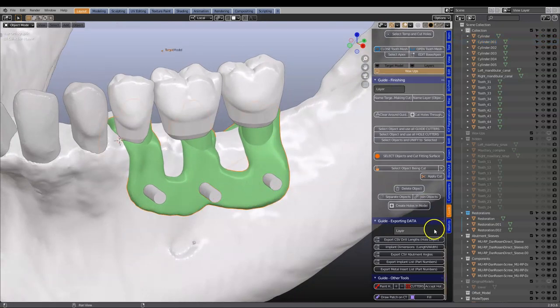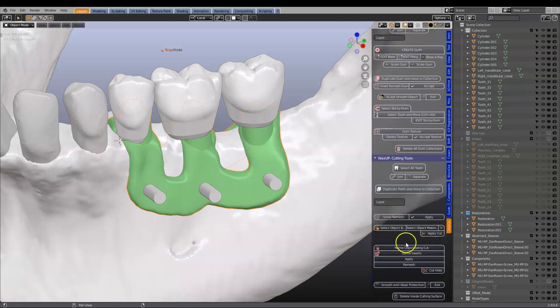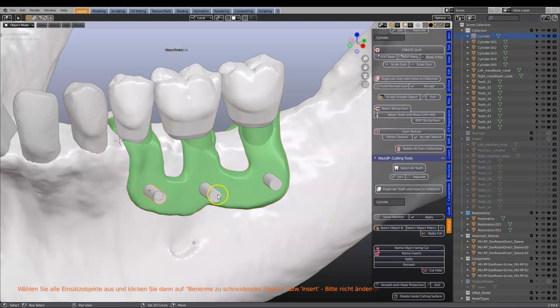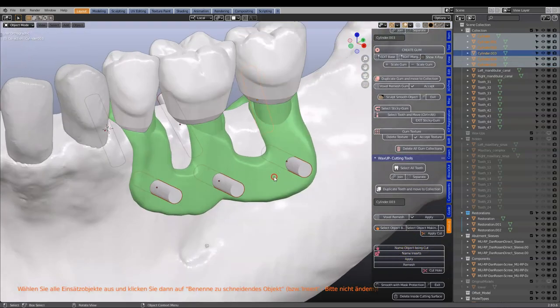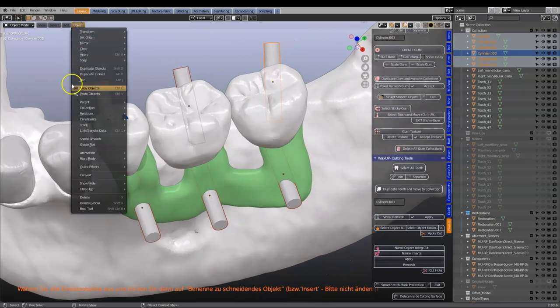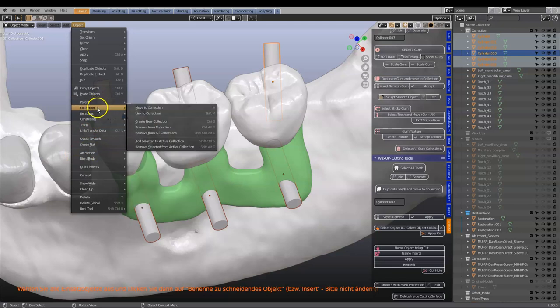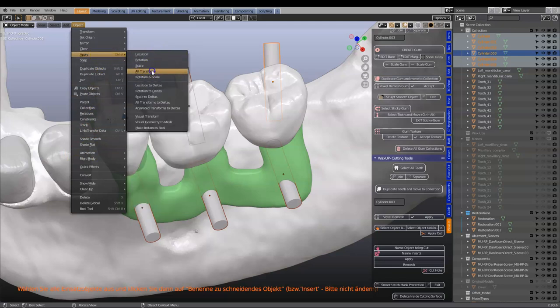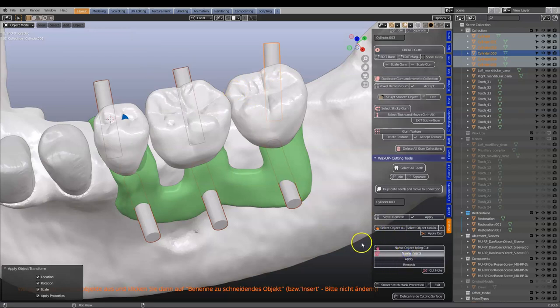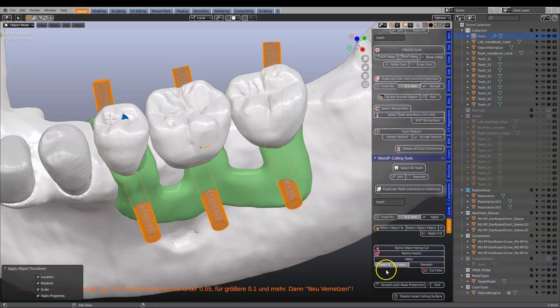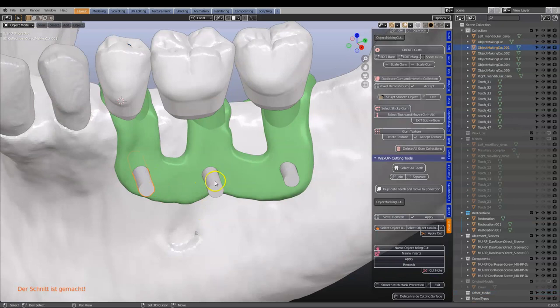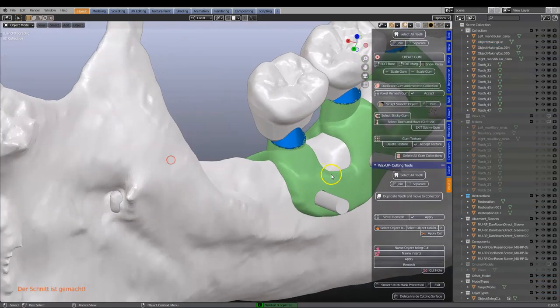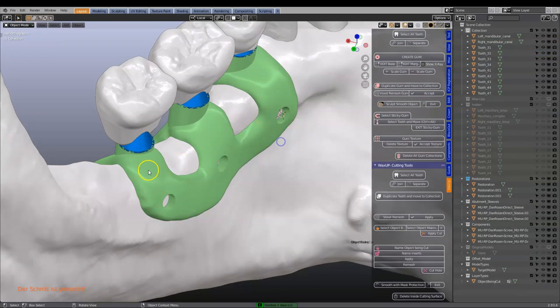Next we're going to select the green part, go to the WaxUp module at the bottom — this is the object being cut — then select all three cylinders as the inserts. Before clicking inserts, make sure you apply the scale of these, which is quite important because otherwise Blender will take a long time to calculate. Apply all transforms, then click 'name inserts' and apply. It will remesh with a spacer and cut the holes. Now this structure is basically finished.